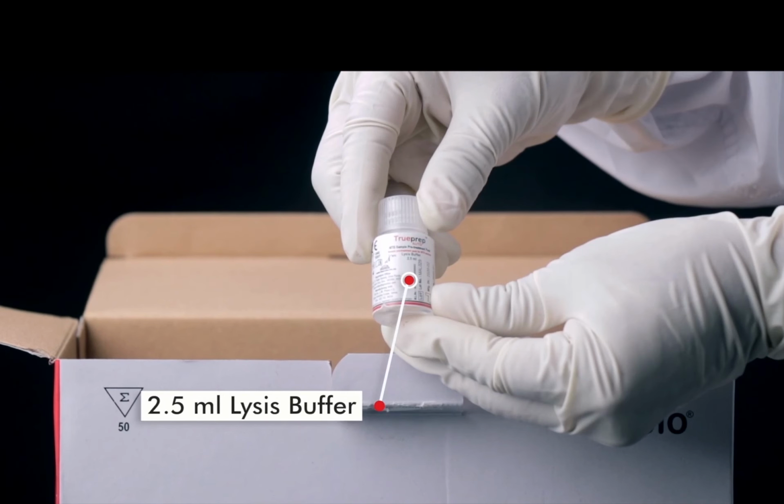Then we get lysis buffer. So this will be present for each sample, lysis buffer. As the name suggests, lysis. Once the entire sample has become liquid, it contains all the cells. It may contain human cells, it may contain other bacteria cells, and it contains TB bacteria cells also.